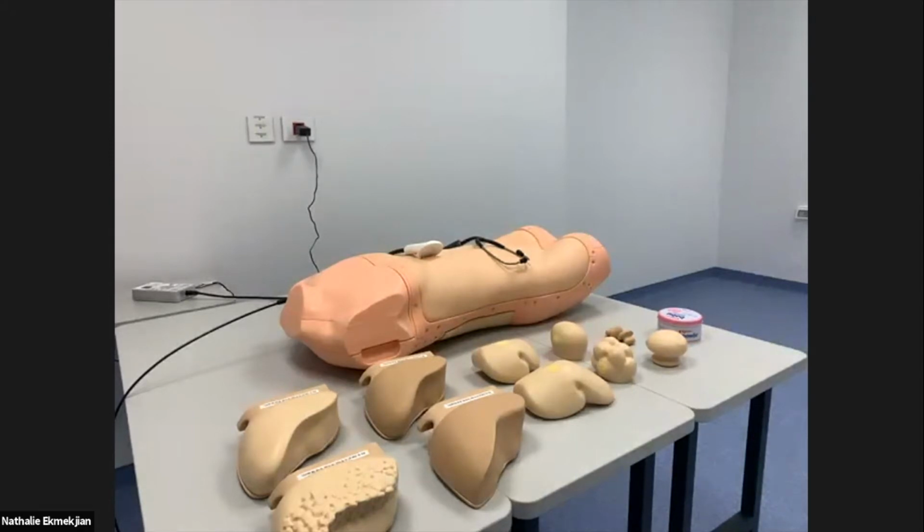Just to introduce myself, my name is Natalie. I'm from Similied. I'm the product specialist for Kyoto Kagaku, and I'm based in Lebanon. I have a brief presentation. Today's demonstration is the abdominal examination simulator from Kyoto Kagaku. It's MW43. I will share my screen.